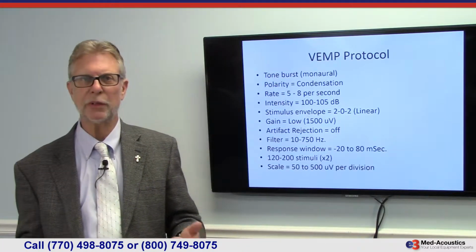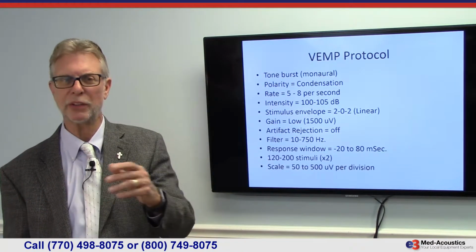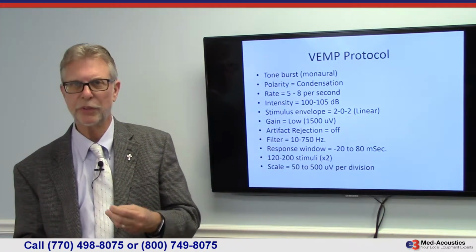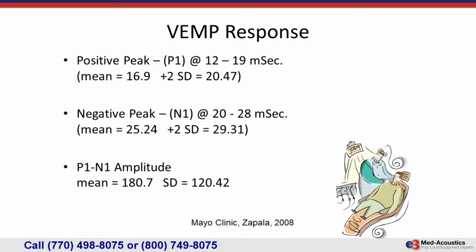Many times when you do this, it's completely off the screen while it's running, and then when the test finishes, I scale it way down so that it comes into the proper perspective. What are you going to get? You're going to get something like this.